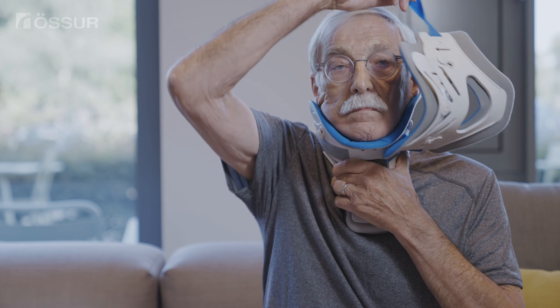While holding the collar front with one hand, slide the collar up the chest wall until the chin is centered in the chin tray. Pass the open strap behind the head and secure the strap to the collar front.